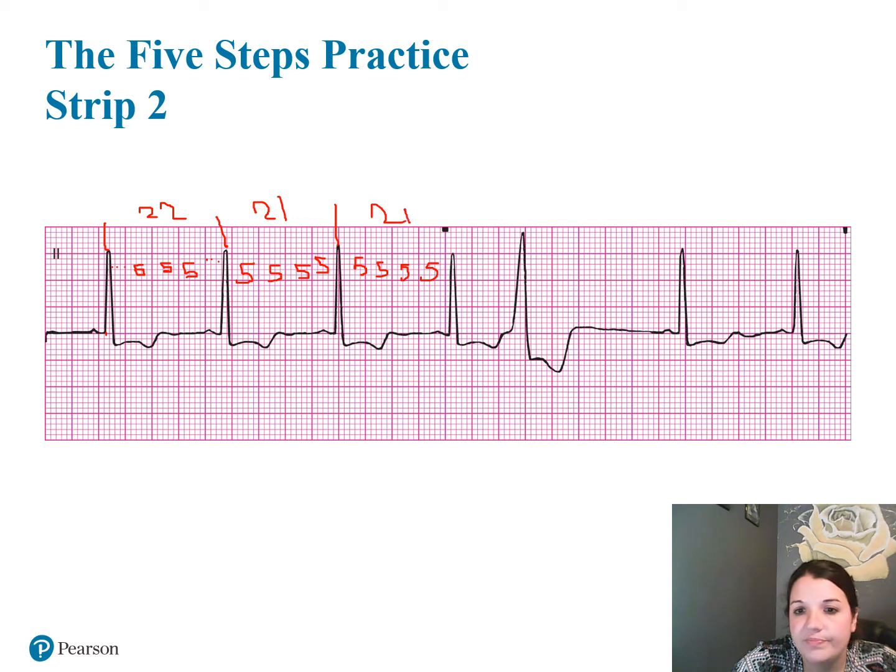Now remember, if I have a premature beat, what do I do? I ignore that beat for my premature beat. And I'm going to count the next 2. 5, 10, 15, 21.